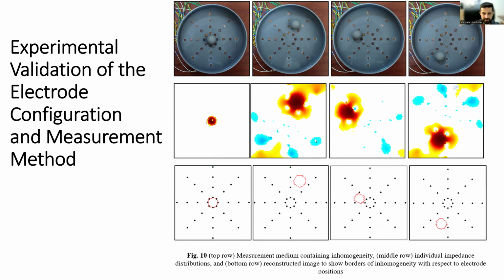To achieve this improved visualization, a sequence of image processing techniques was then applied. Initially, the color image produced by ADORS was converted to grayscale to simplify the subsequent processing steps. The grayscale image was then normalized, standardizing the pixel intensity values for consistent thresholding performance.